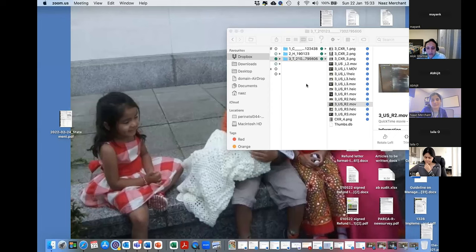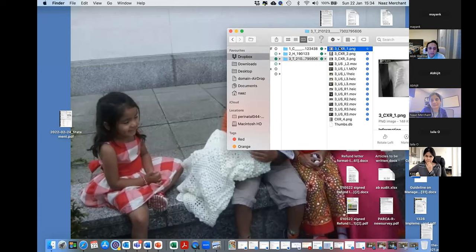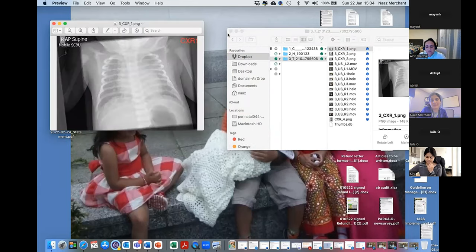I think if you look at the entire ethos of the presentation at this particular point, it's so beautiful to be able to see these images. But what I'm going to emphasize to you is the importance of taking history and clinical correlation. None of the images in that last baby had any evidence of shred sign. Irregular pleura was seen in certain areas. It was more blurred than irregular, and blurring is a very common sign seen with fluid. So if you've got irregular pleura, which is broken with a shred sign, you need to think possibly of an infective cause. You can also see it with BPD.